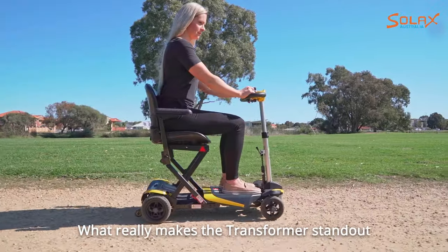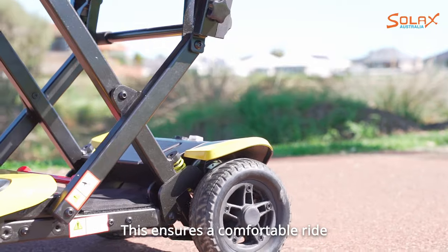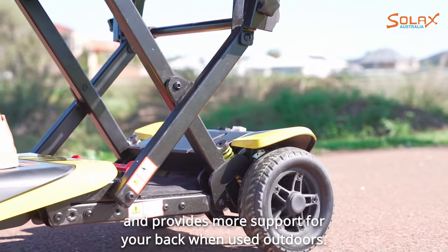What really makes the Transformer stand out is the addition of rear suspension. This ensures a comfortable ride and provides more support for your back when used outdoors.